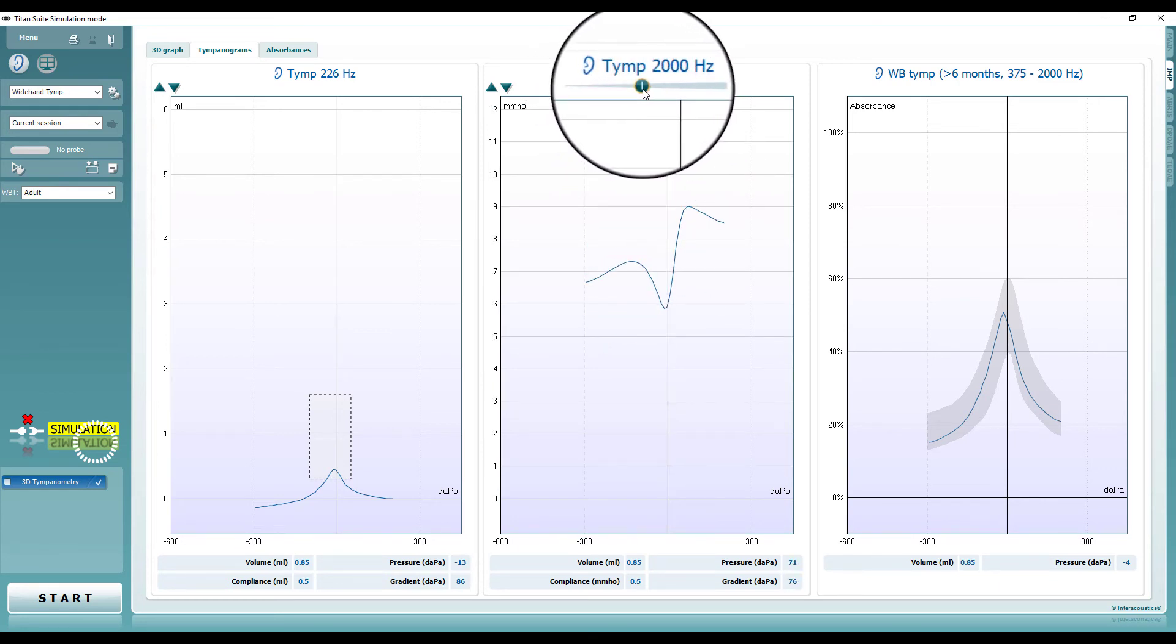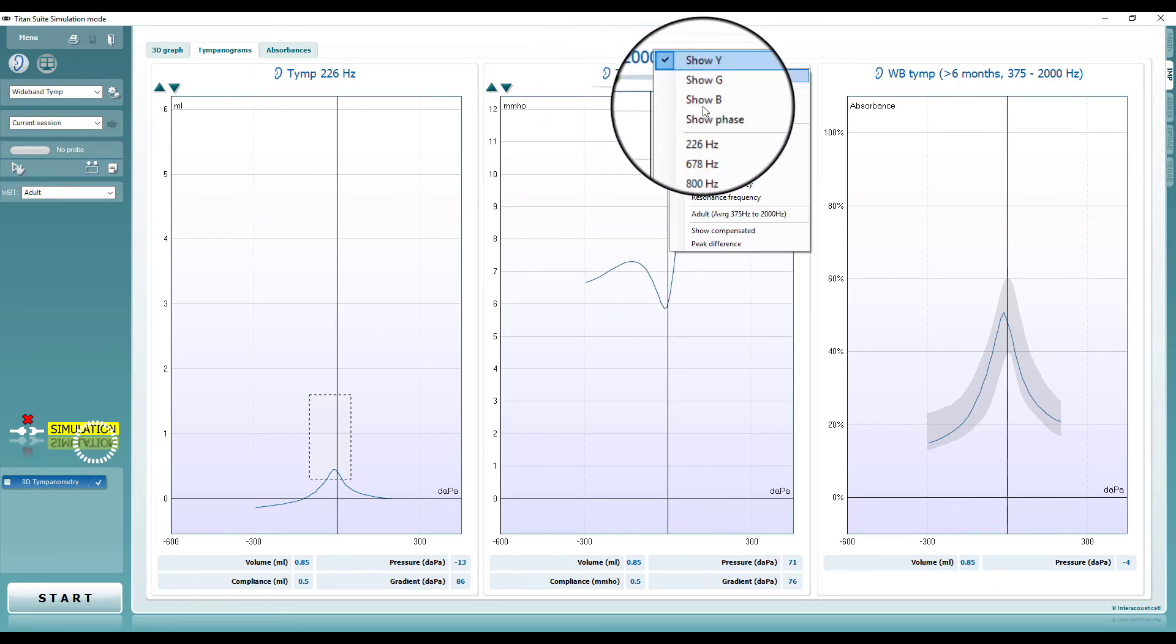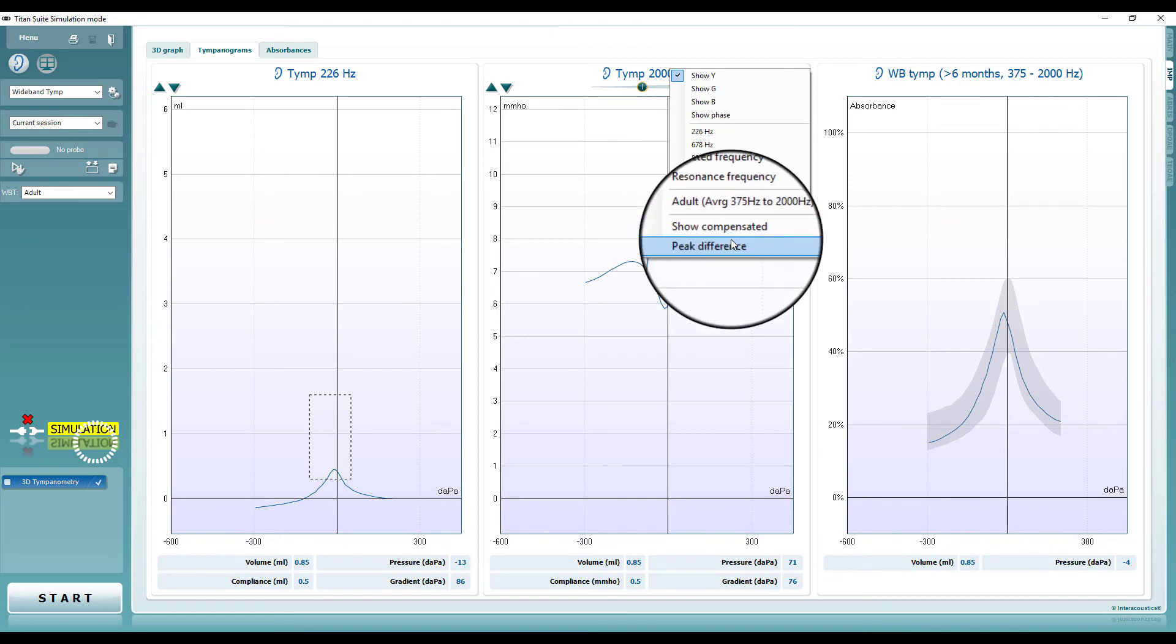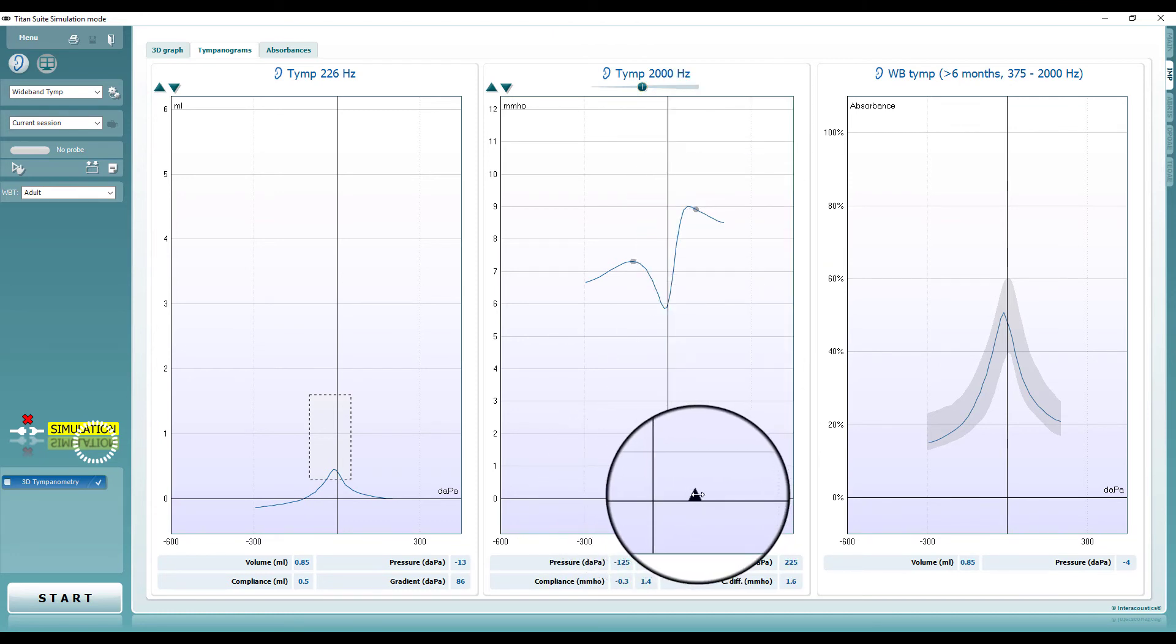It is possible to display the tympanogram for any selected frequency, which in combination with the peak difference measurement allows for further analysis of the results.